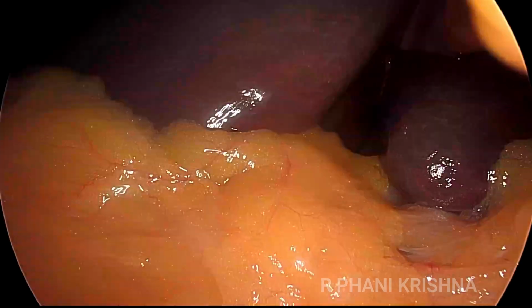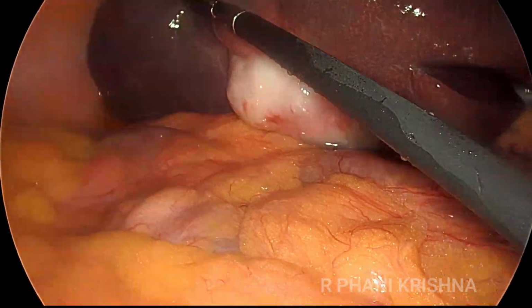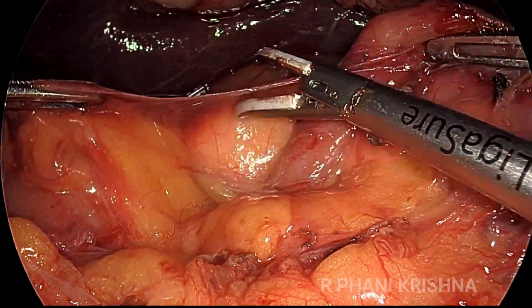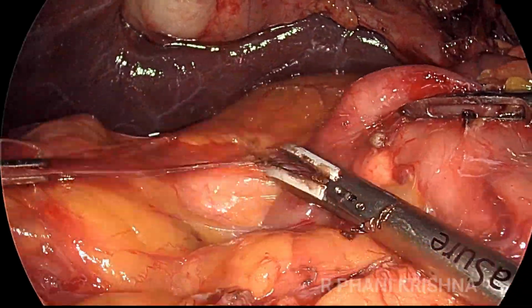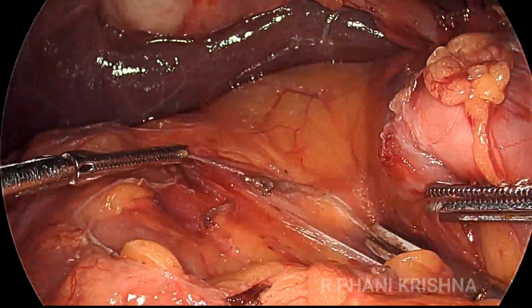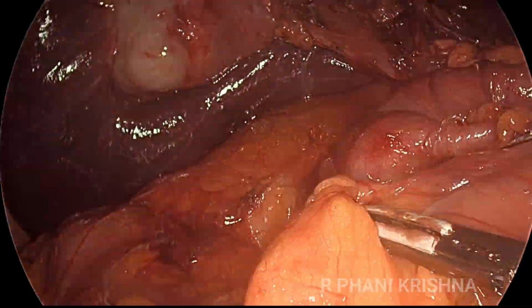After an initial diagnostic laparoscopy looking at the liver, omentum, and peritoneum for deposits, the first step involves Kocherization of the duodenum and biopsying the retroperitoneal lymph nodes. Obviously, involvement of these nodes would restage it to M stage, so we biopsy them and send them for frozen section.